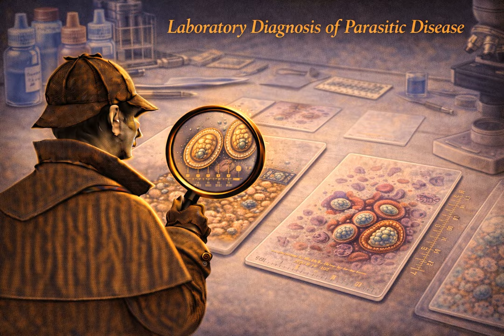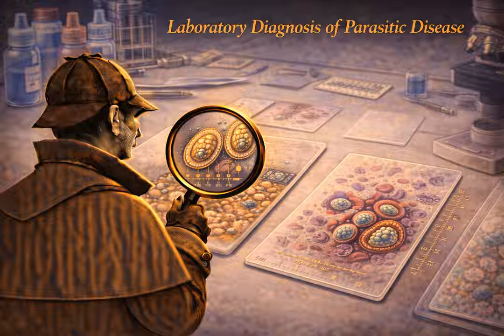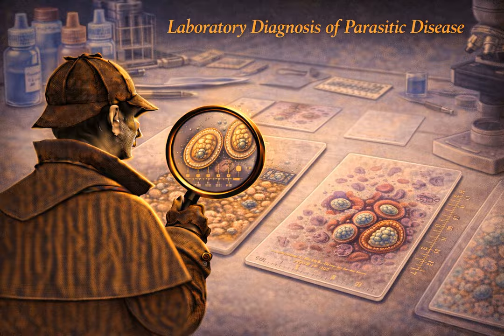Finally, skin. What are we looking for in the skin? This is primarily for Onchocerca volvulus, which is the nematode that causes river blindness in Africa. The adult worms live tangled up in these hard subcutaneous nodules, literal lumps, right under the skin. So do you just take a scalpel and biopsy the lump? You can, but that requires minor surgery. The much easier diagnostic test is called the skin snip.